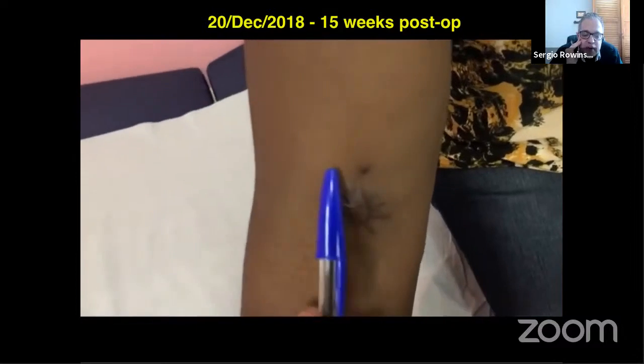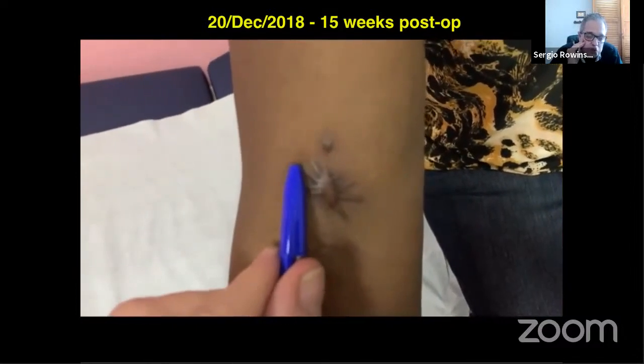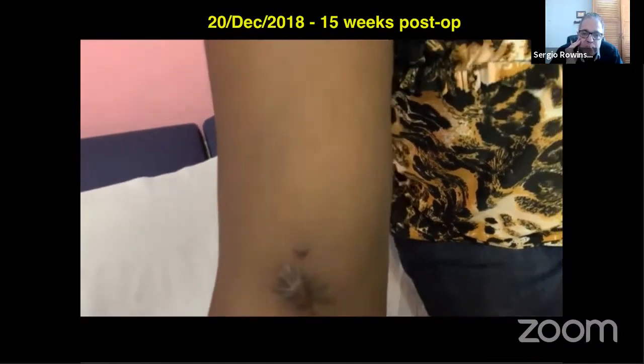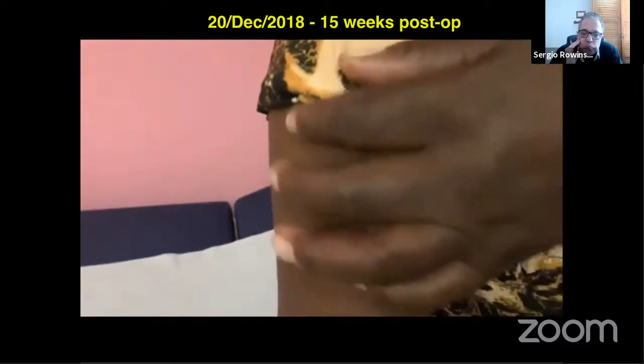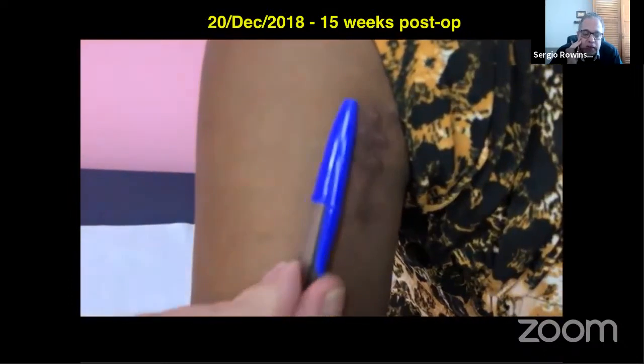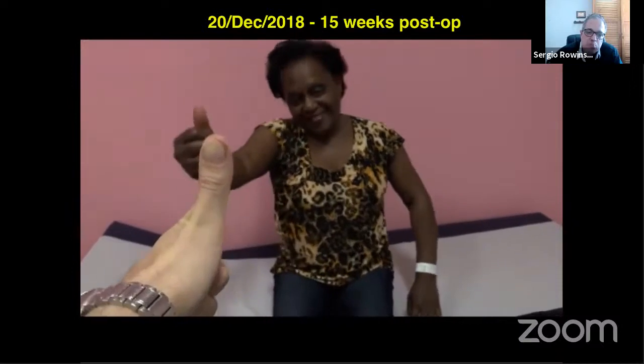See the size of the incisions. I'm very proud of the size of my distal incisions. This is not percutaneous, this is MIPO. But I'm very proud of doing such small incisions with the way I have been developing it. And the proximal is always like this, not so small, but she's absolutely fine from a clinical point of view. She's smiling, this is what I want.